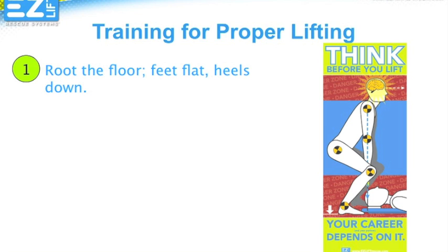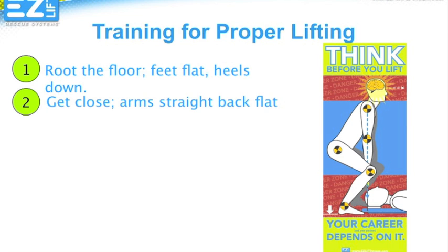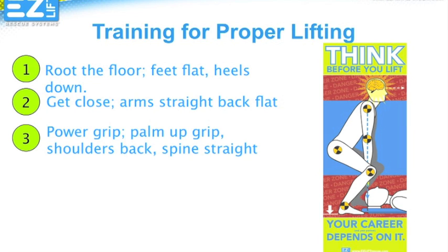Just as you never see a power lifter simply walk up and lift the weight, you should make sure you're in the right position, beginning with your feet. We call this rooting your feet to the floor, making sure your feet are flat and your heels are down. Stand as close as possible to the object being lifted. In the case of the EZ-Lift Rescue System, the handle should be between your knees.